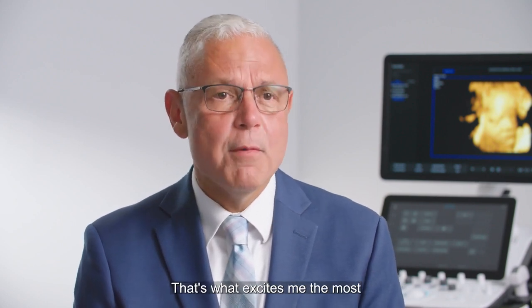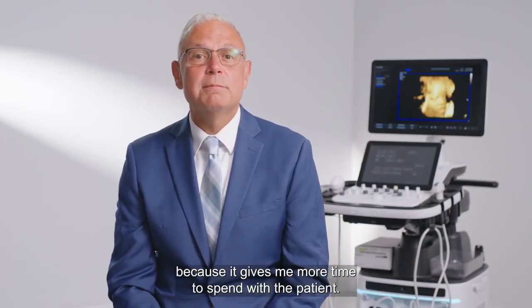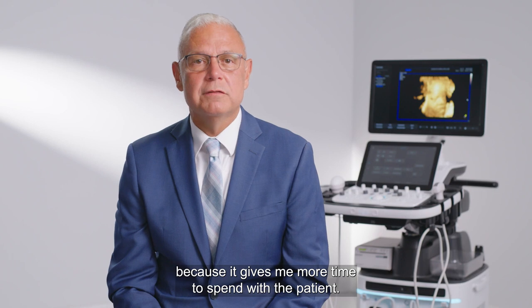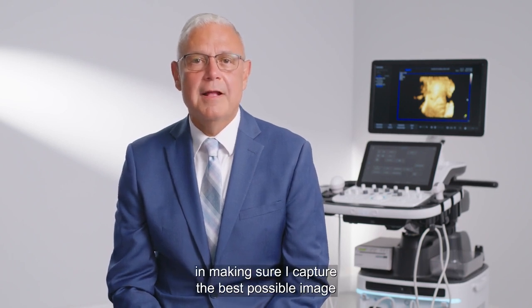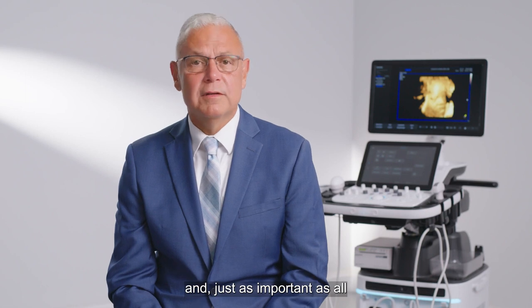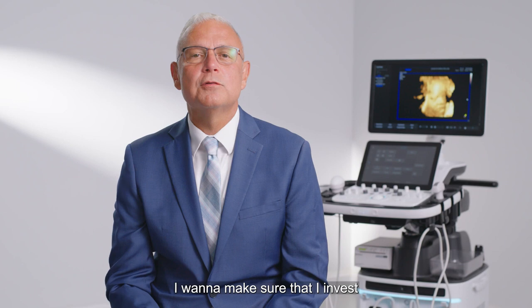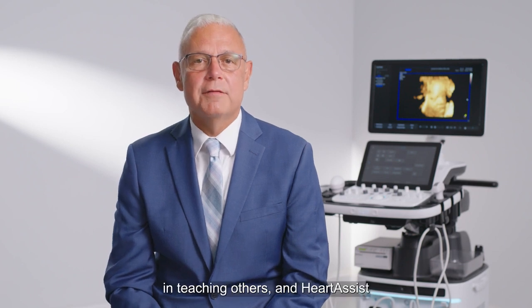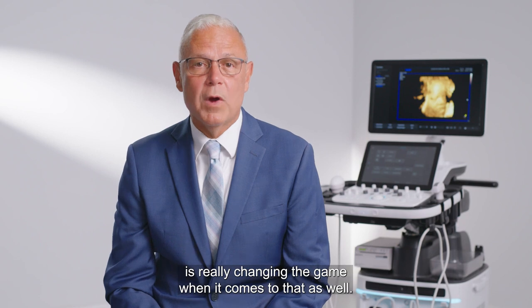That's what excites me the most, that it's going to really make a difference, because it gives me more time to spend with the patient. It gives me more time in making sure I capture the best possible image. And just as important as all of those other things, also educating. Someone taught me, I want to make sure that I invest in teaching others. And HeartAssist is really changing the game when it comes to that as well.